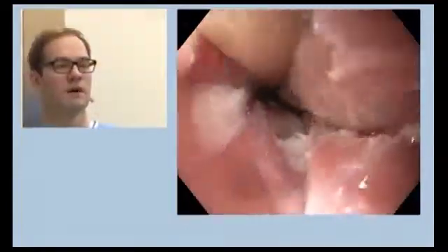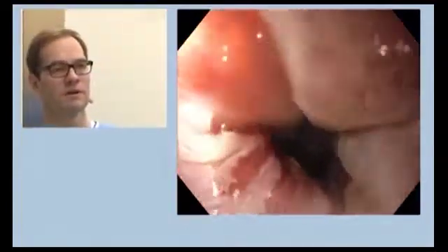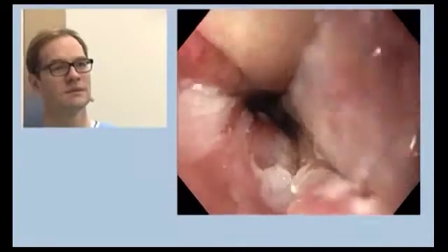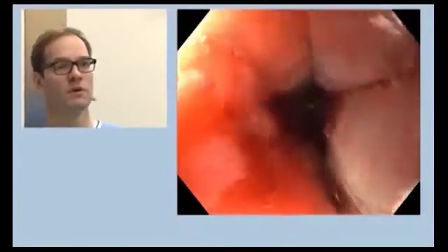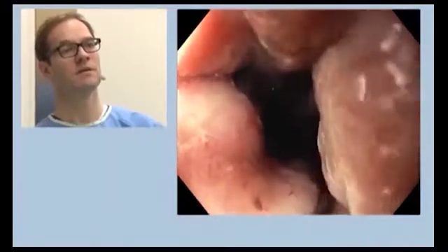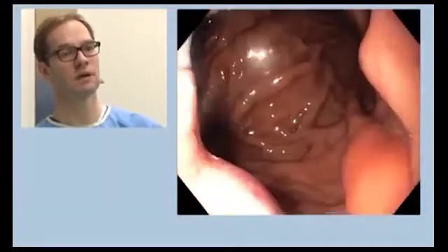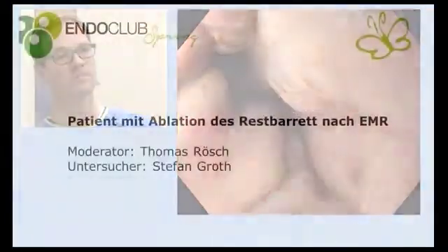Now we are through the second round of the double-double technique. You can see this typical brownish epithelium — the burnt epithelium — and what it looks like. And we've caught the transition with the Z-line quite well.